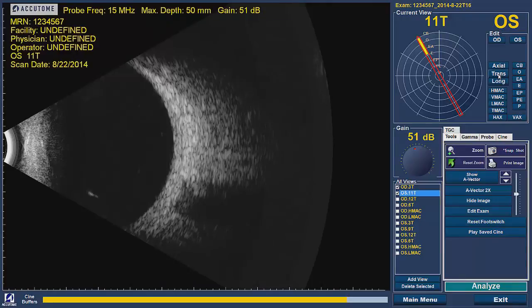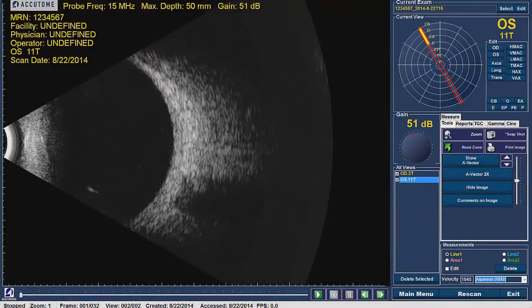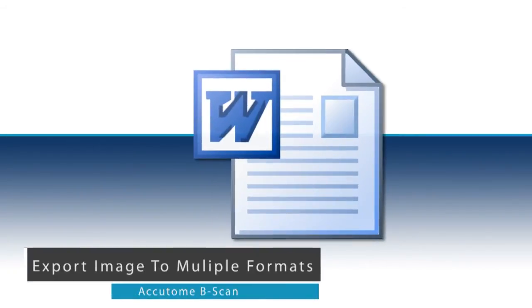Once scanning of the eye is complete, click on the Analyze button located in the bottom right hand corner of the screen. The software will change into a new Analyze screen where you can review and replay patient scans, take photos of the scans, comment on the images, apply measuring calipers, adjust the gain settings, and export images to EMR or a Word document report.